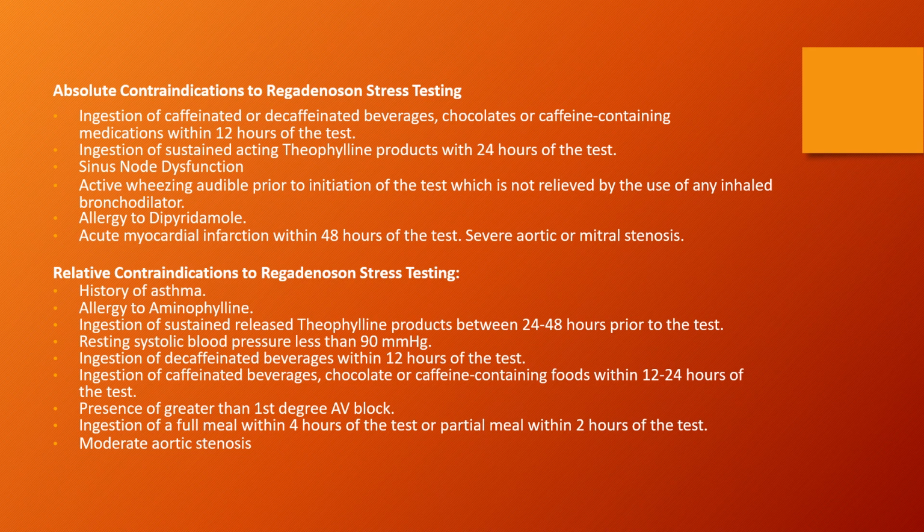So best practice when we tell the patients to be NPO, that means absolutely nothing by mouth, not even water. Some patients have to take their medication in the morning. If that is the case, then they need at least 2 to 4 hours after they've taken that medication before they can have the test, and they should be NPO during that time.